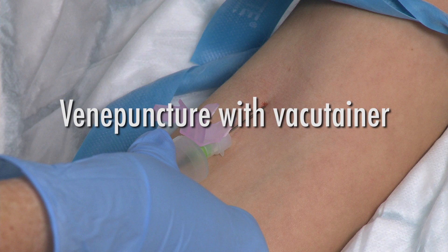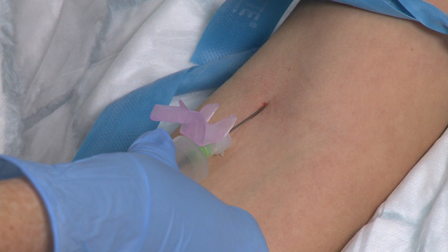Welcome to the venipuncture video. Here we will demonstrate the use of a vacutainer.